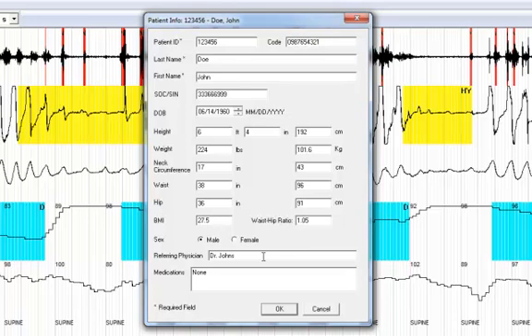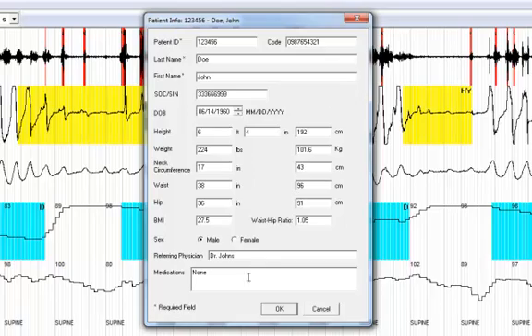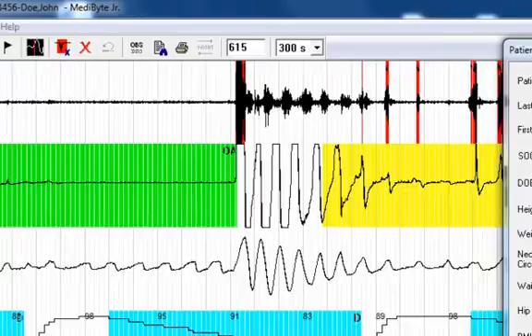During the Metabyte configuration or setup process, which is explained in a separate video, it asks you for patient last name, first name, weight and ID. You can change any of that information in this field after the recording is completed. If you wish to enter referring physician or medications, you may enter them in these fields here.